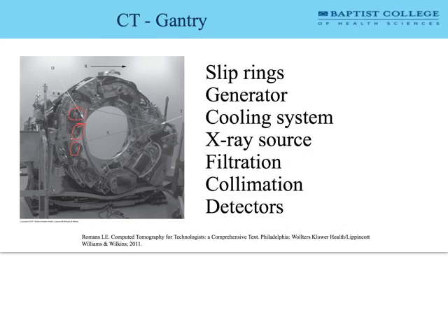There's a bunch of different advantages for different detector materials, and it's something that is continuing to evolve. I would say that most of the evolutions in CT hardware have culminated in the technology that we have now, and moving forward we're going to see more of an evolution in software and software design. So right now you don't need to know or memorize what detector elements we're using, other than to understand that it's a solid state crystal.